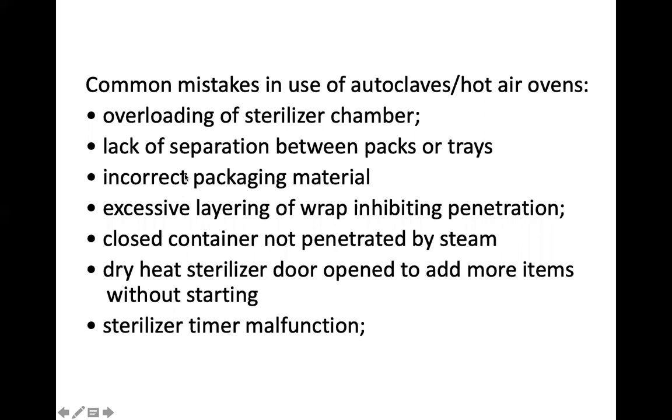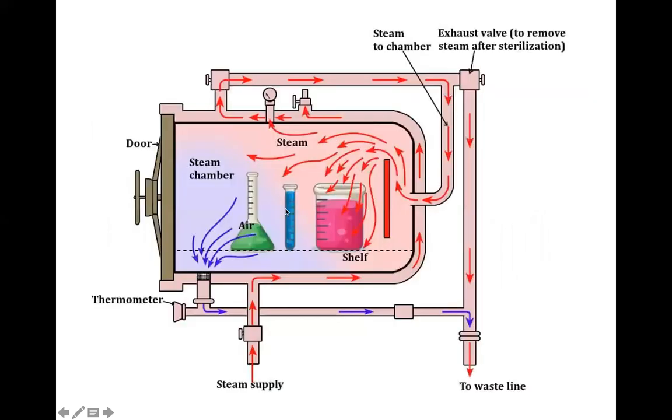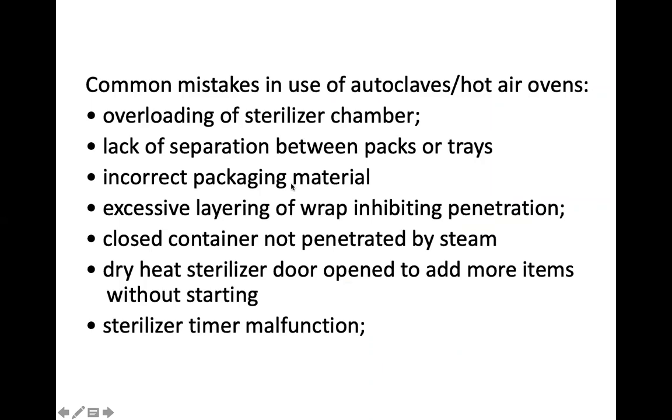If you wrap them with incorrect packaging material, it means the steam will not be able to perfuse the packaging material, okay, to penetrate properly so that the cotton swabs get sterilized. So have correct packaging material. And even if the packaging material is correct, do not layer it excessively, okay? Excessive layering of the packaging material will also inhibit penetration of steam or hot air, okay?